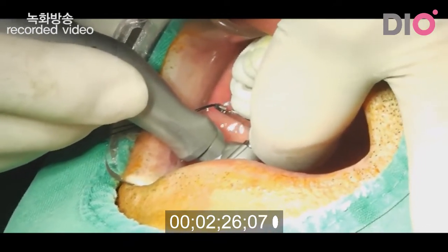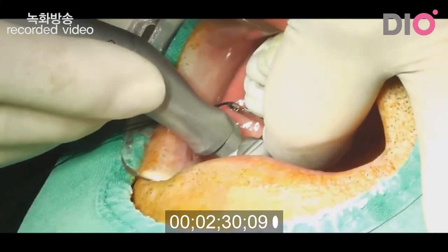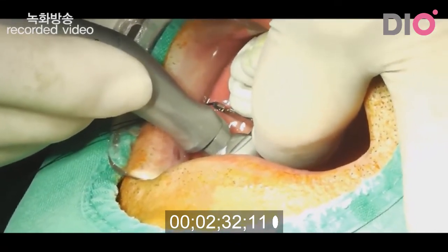I will drill until the stopper touches the tube.